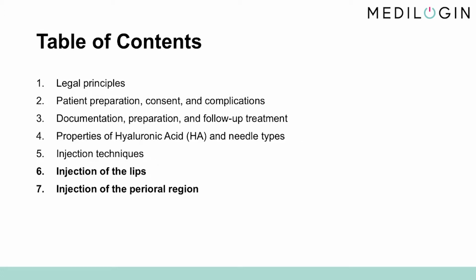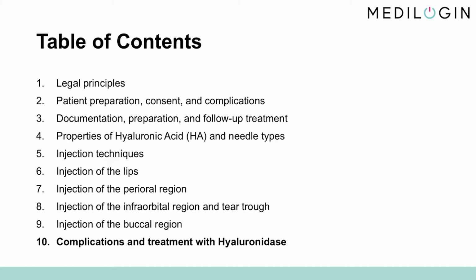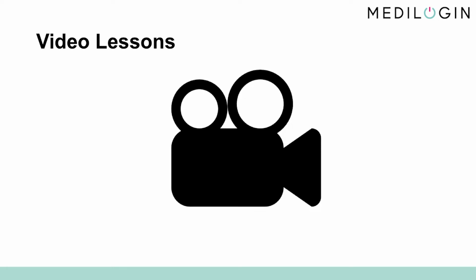With the help of video demonstrations, we'll guide you through injection treatments of the lips and perioral area, the tear trough, and the cheeks. Equally as important, we'll provide you with detailed instructions on managing possible complications and administering hyaluronidase. With our basic course, we offer 4 step-by-step video lectures that cover all the important bases regarding hyaluronic acid treatment of the lips and perioral area, the tear trough, and cheeks.